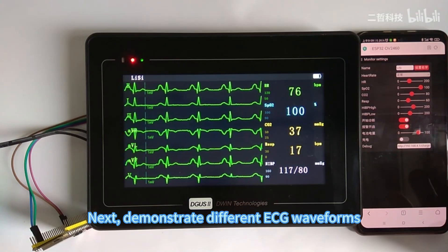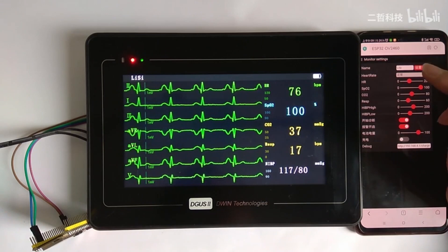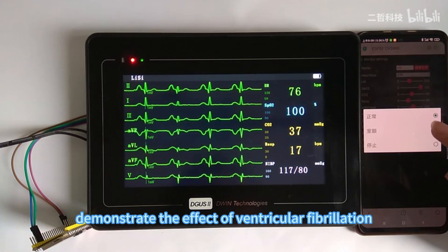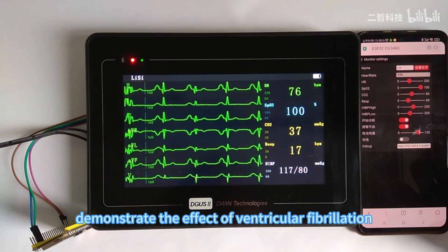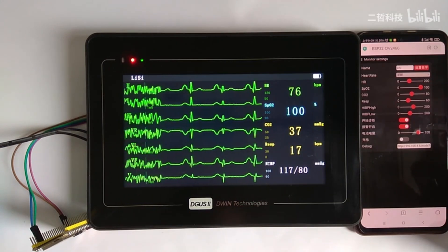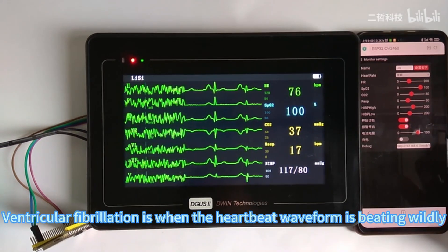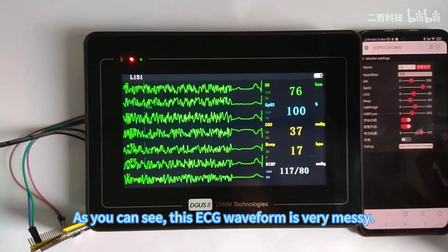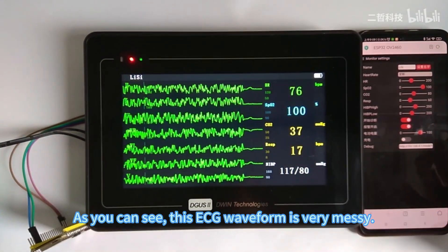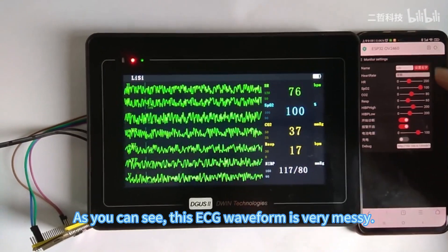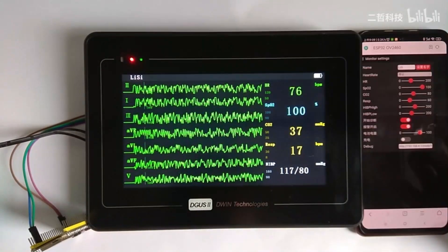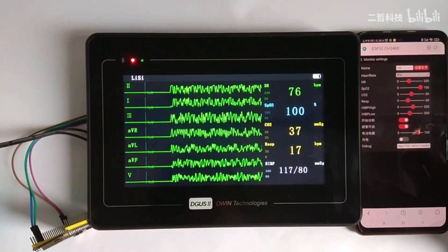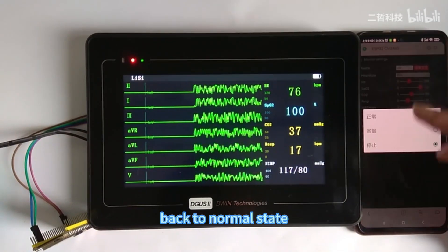Next, we demonstrate different ECG waveform types. There are three types: normal, ventricular fibrillation, and stop. Ventricular fibrillation is when the heartbeat waveform is beating wildly — as you can see, the ECG waveform is very messy. The stop state displays as a straight line. Then we return back to the normal state.